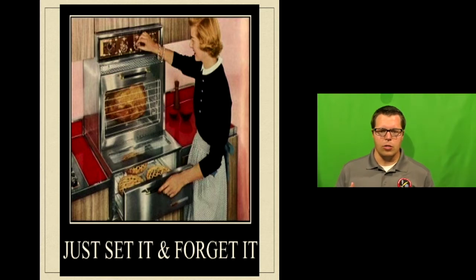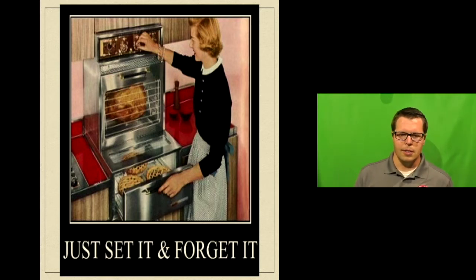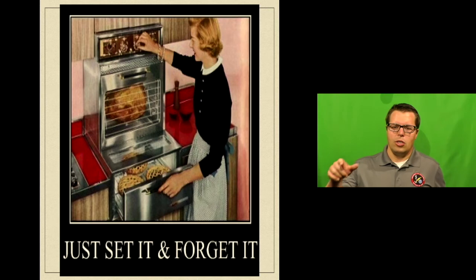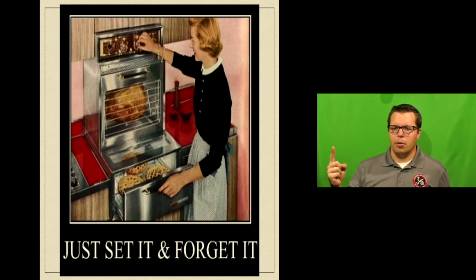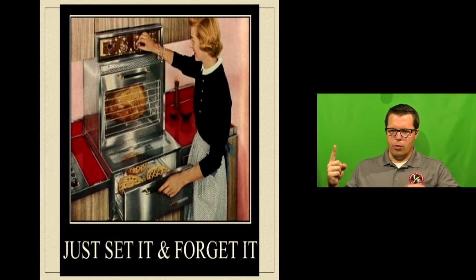Likewise, all the stuff like your CO2 measurements that you're going to be looking to titrate stuff with, that's not going to change instantaneously. It's going to take a couple of minutes to happen. It's going to take a couple of minutes just for blood to go from your lungs all the way out to your finger where your pulse ox is. So give it a couple of minutes to see how things actually go.